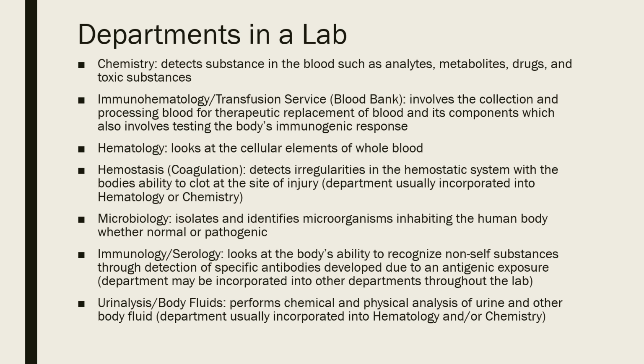Hematology is going to look at the cellular components of blood. So with your hematology department, you're using whole blood because you're looking at the red cells in their normal environment where they're free floating. So you don't want this tube spun down. Hemostasis is going to look at your ability to coagulate, your ability to form a clot. Sometimes this is such a small area, it's kind of incorporated into the hematology or the chemistry department. But they're going to have the citrate, that light blue tube, which is what your hemostasis department is going to use.